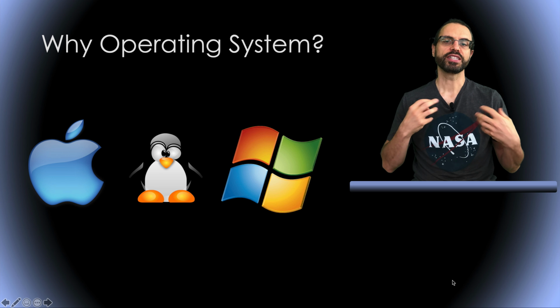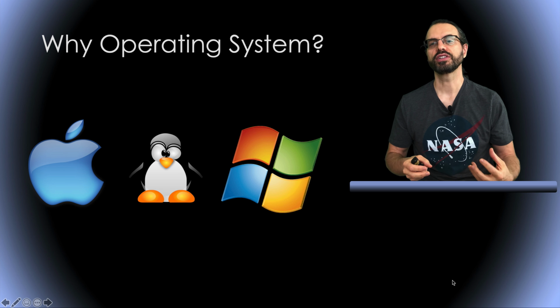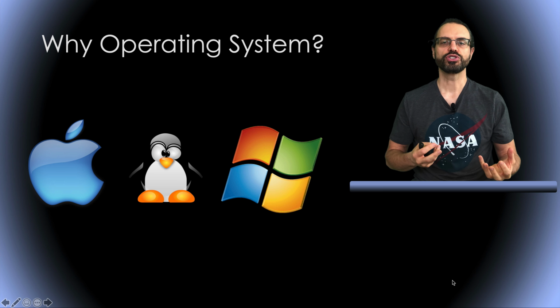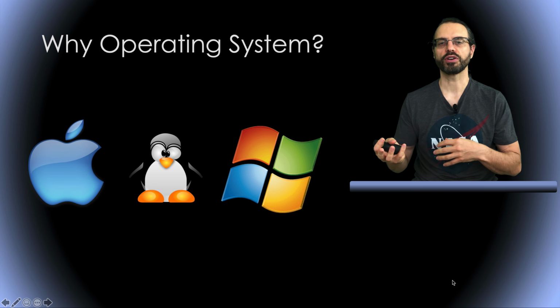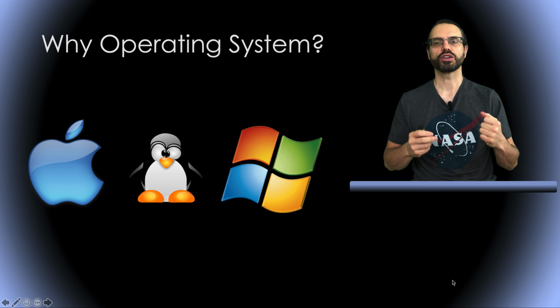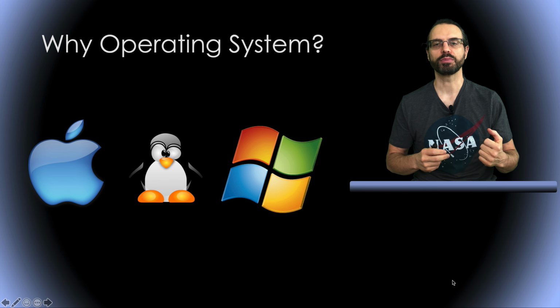In terms of operating system and to achieve maximum stability, there is really no preference, and all operating systems are fully supported. For naive users, we recommend Windows and macOS because it is sometimes harder to configure graphic drivers for Matlab on Linux. We recommend using a computer with at least 8 GB and if possible 16 GB of memory or more.